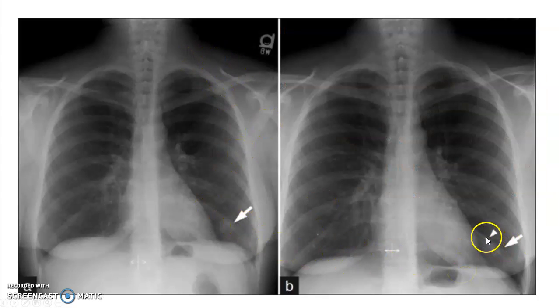But you can see the small little BB here is identified because they were looking at this nodule. So they were trying to determine if this was actually the patient's nipple or not. And as you can see with the nipple markers up here, it is not, and the mass is still here. So that's what those are.